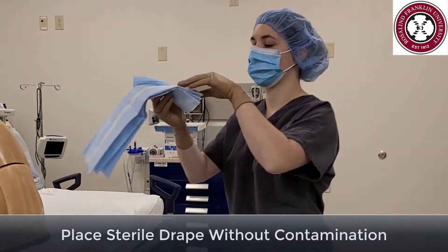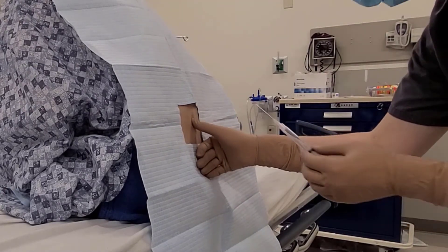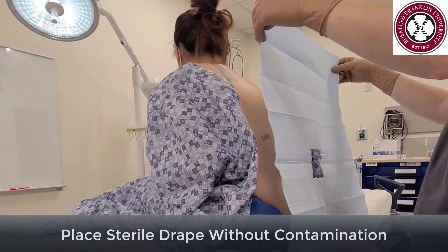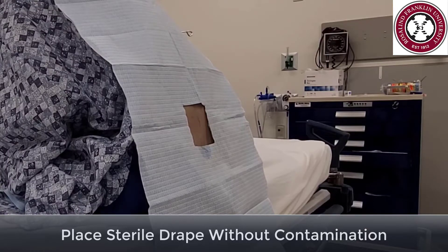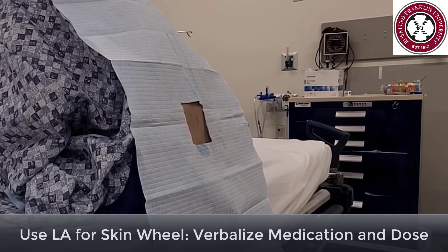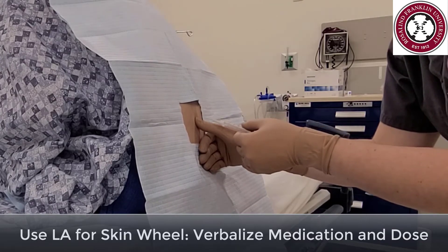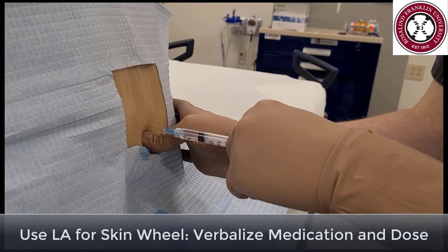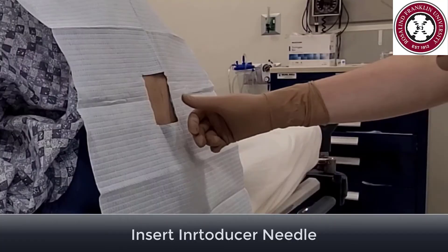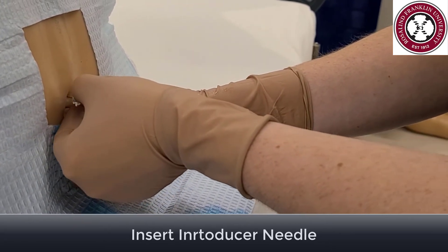We will begin the procedure by placing the sterile drape. Warn the patient that it is going to be cold and sticky. Be sure not to contaminate the drape while removing the backing to the adhesive strip and securing the drape to the patient's back so that your target interspace is in the middle of the opening. Remind the patient to get into the correct position. Grab your 3 ml syringe with the 1% lidocaine, find your target interspace, warn the patient it will sting and burn, raise a skin wheal, and inject lidocaine through the needle's path. You may use it as a finder needle to locate any obstacles in your projected path. Next, insert the introducer just until seated — having the introducer too deep in a petite patient could puncture the dura.